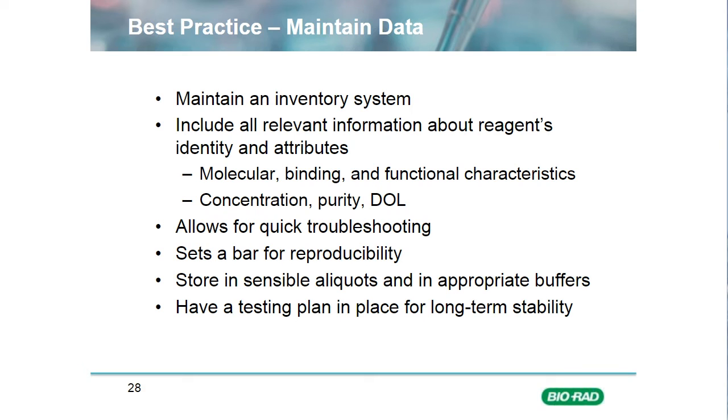With aliquoting, certainly when we're providing reorders of material, we tend to aliquot and then we freeze, and then we thaw one vial and conduct a QC test on that vial, so that we're confident that all the material that we've shipped should be well represented by the lot we've actually evaluated, because it's been through the same number of freeze-thaw cycles as the material will have been when the customer comes to thaw and use that material.